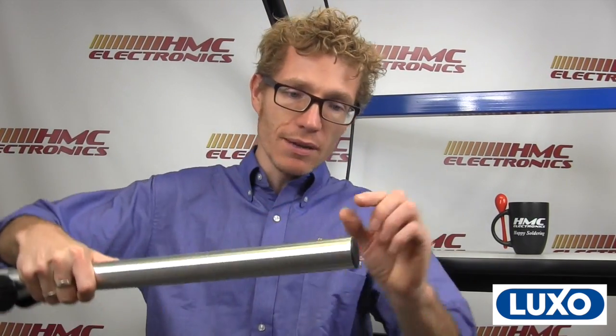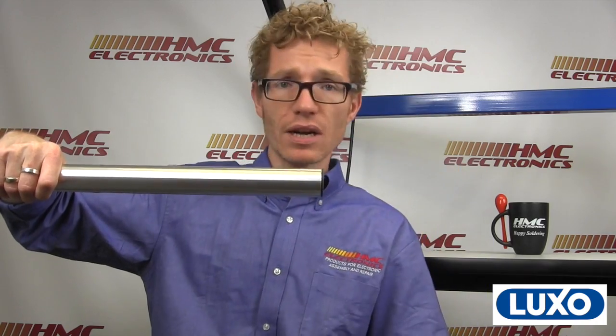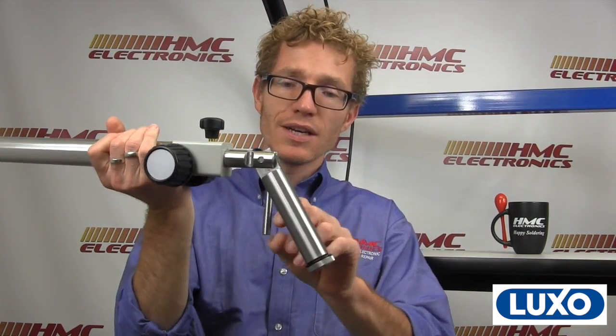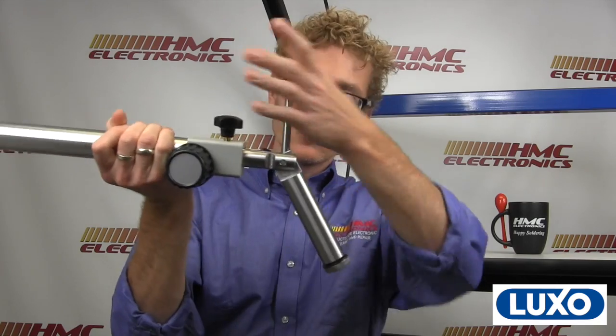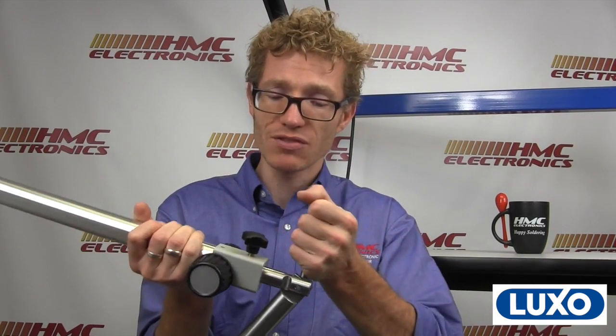This right here is the horizontal bar. Luxo does this great thing where all of their boom stands have these integrated drop-tilt arbors. What's a drop-tilt arbor, and what is it for? If you think about a traditional microscope, the end of it would just literally look like this — you'd have an E-arm which connects into that microscope, looking straight down. If you have a drop-tilt arbor, you can look at an angle, lock it, and look at the product at a slightly offset position. On a regular microscope, if you've got one that didn't have this, they're a couple hundred dollars extra. So it's great that Luxo actually includes it with their standard boom stand.